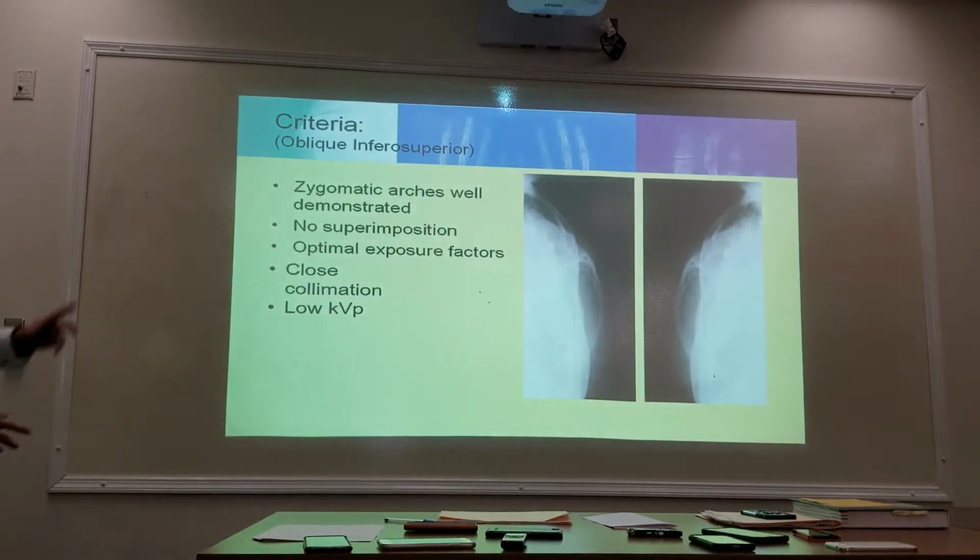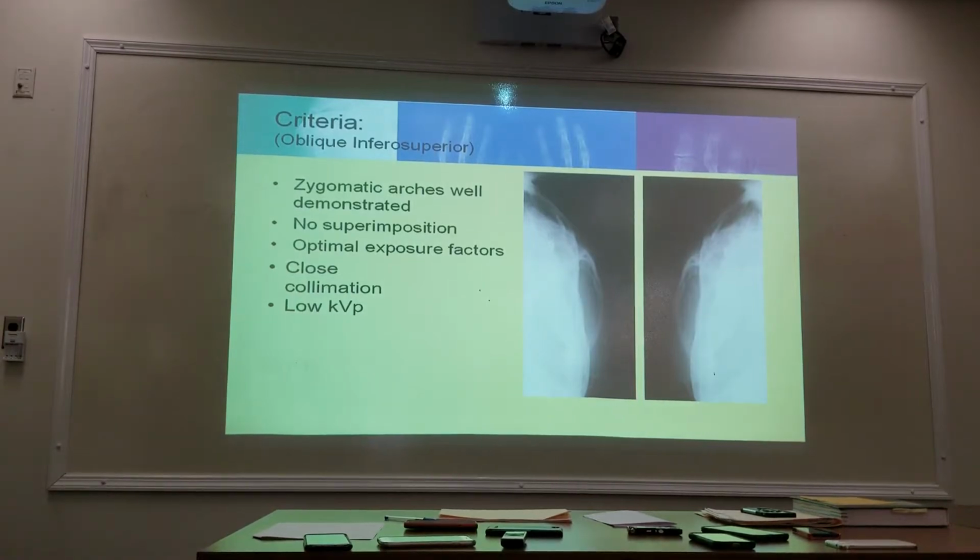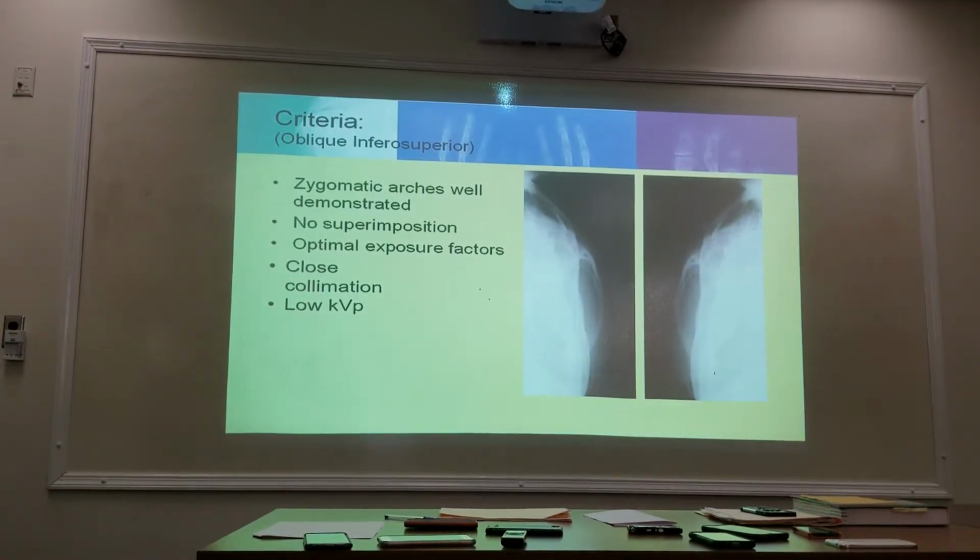So again, if we're doing the oblique inferosuperior, this is for unilateral, just one. Okay?